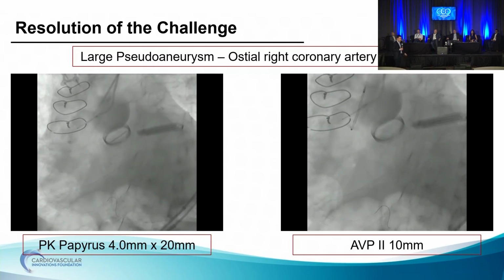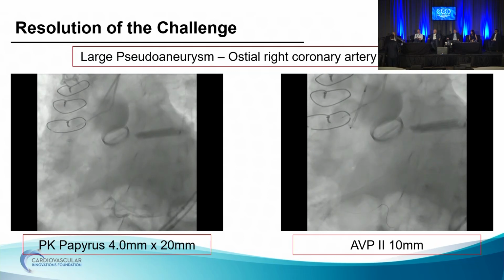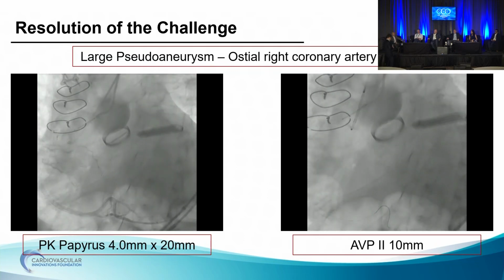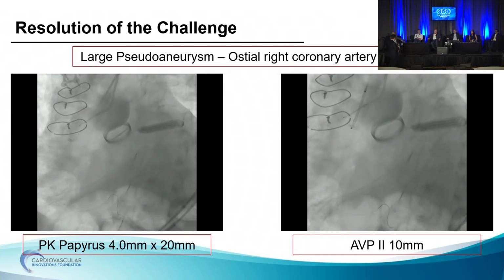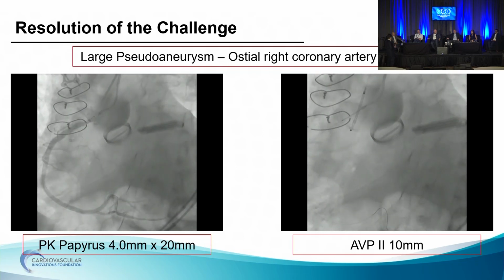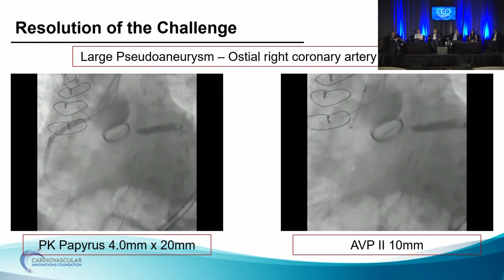They are sharing an ostium. It's very close. It's kind of sharing. On CT, I can show you. They're literally one next to each other. It's not really originating from the ostium of the right, but it's so tightly close that you cannot safely do one without the other.